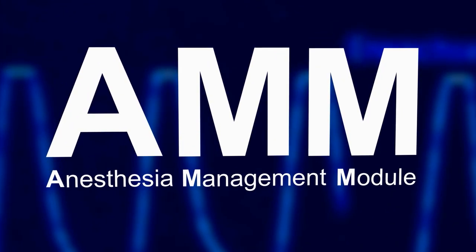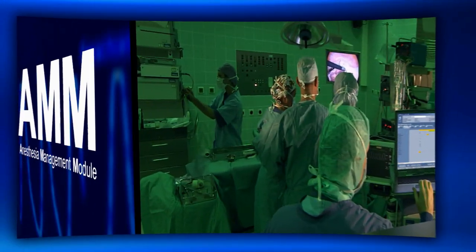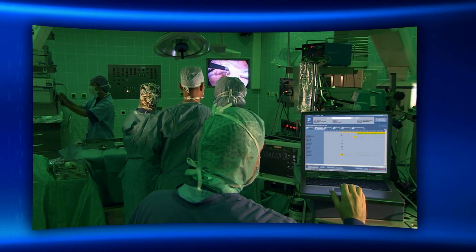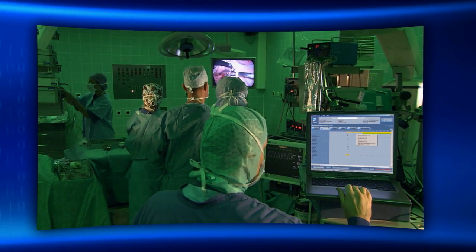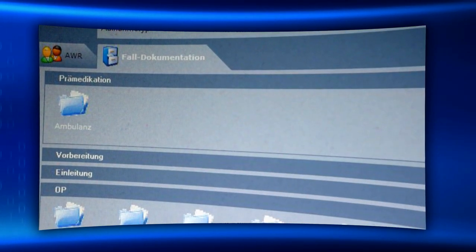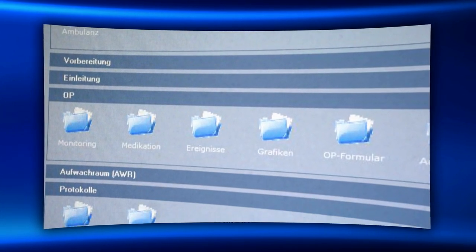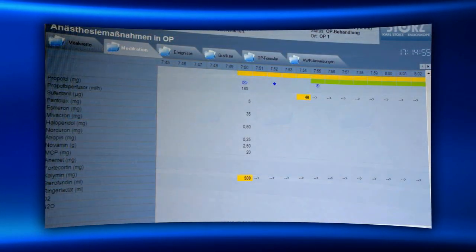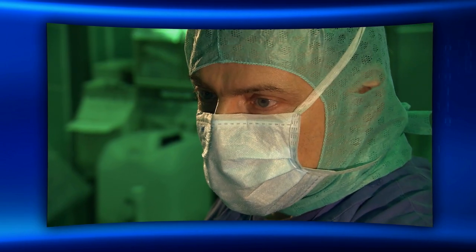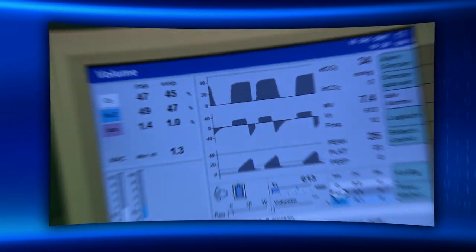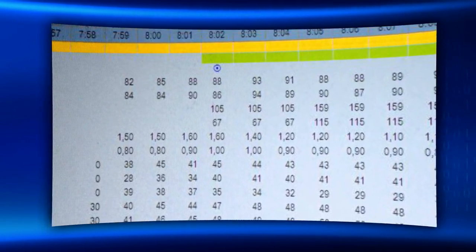Anesthesia Management Module. With the Anesthesia Management Module, the pre-, intra- and post-operative vital parameters and drug consumption in each intervention are exactly documented and can thus be charged to a specific account.